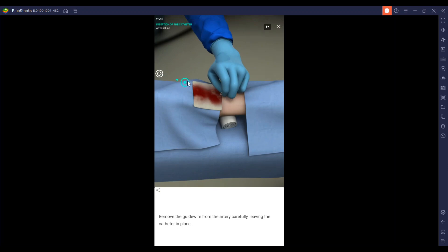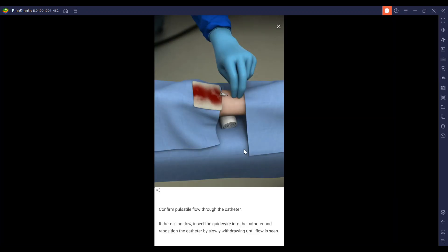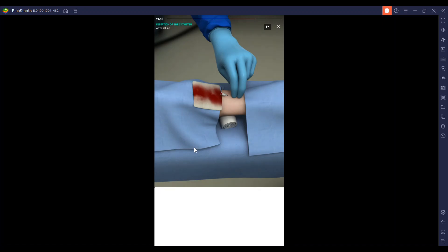We're going to remove that guide wire from the artery, carefully leaving the catheter in place. We're going to confirm pulsatile blood flow through the catheter. If there's no flow, insert the guide wire into the catheter and reposition it and redo the rest of the steps.